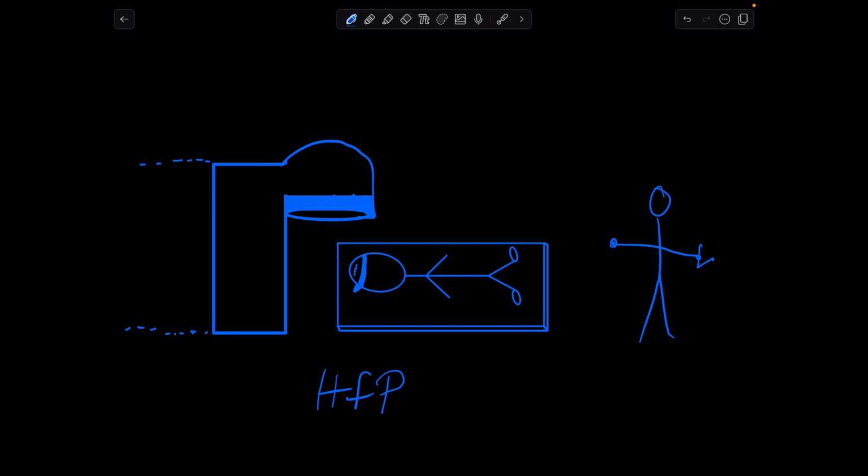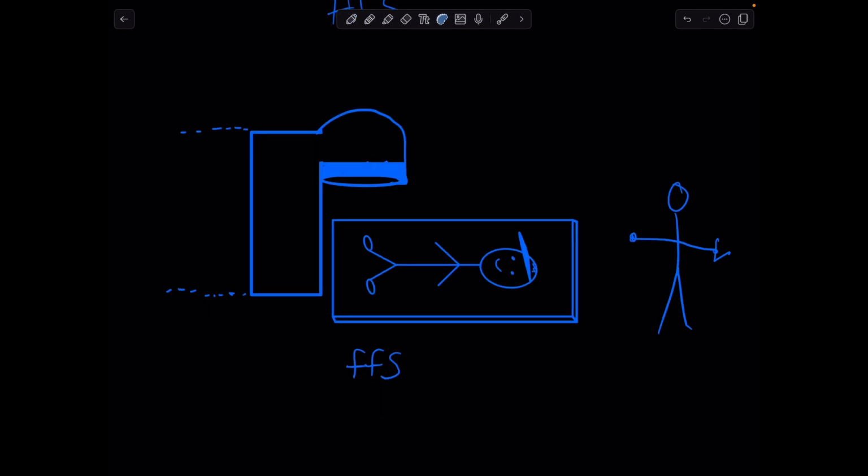Now, you want to try to imagine that for each one of these. Now, imagine you're at the feet of a patient that is head first prone. Can you label the patient's left or right? Pause the video and try. Okay, so the patient's right is actually going to be the same right as yours, and their left is also going to be the same as yours in this case. Now try to label the patient's right in this case. You're again pointing towards the patient.